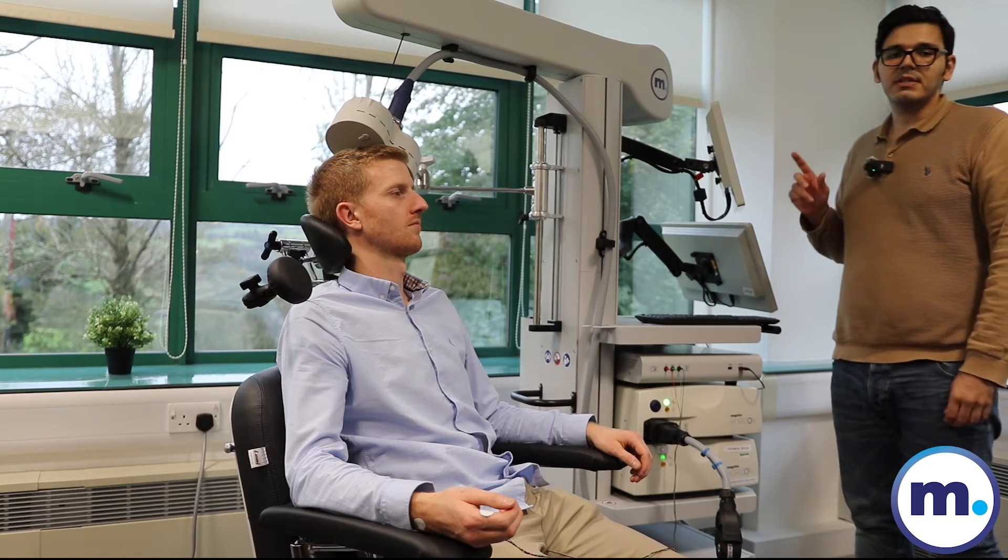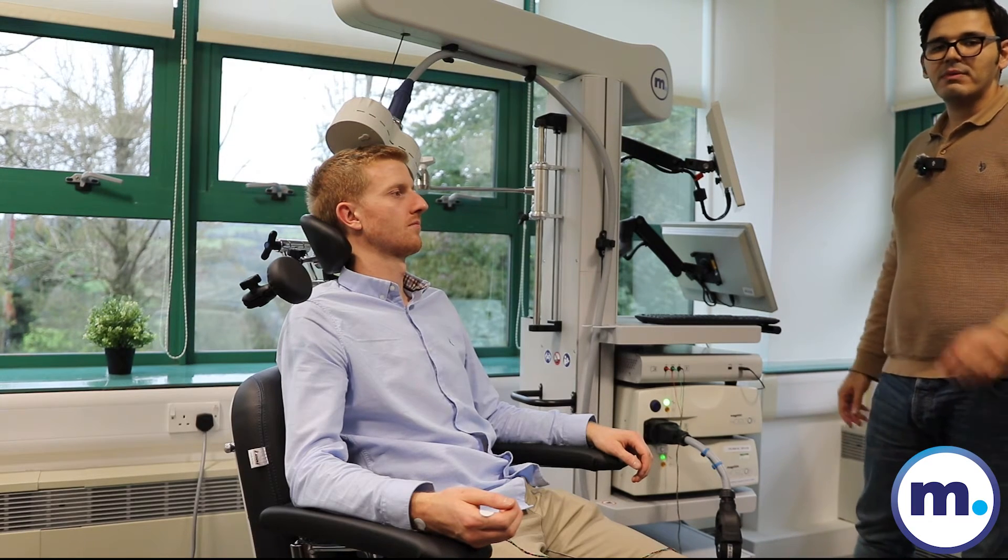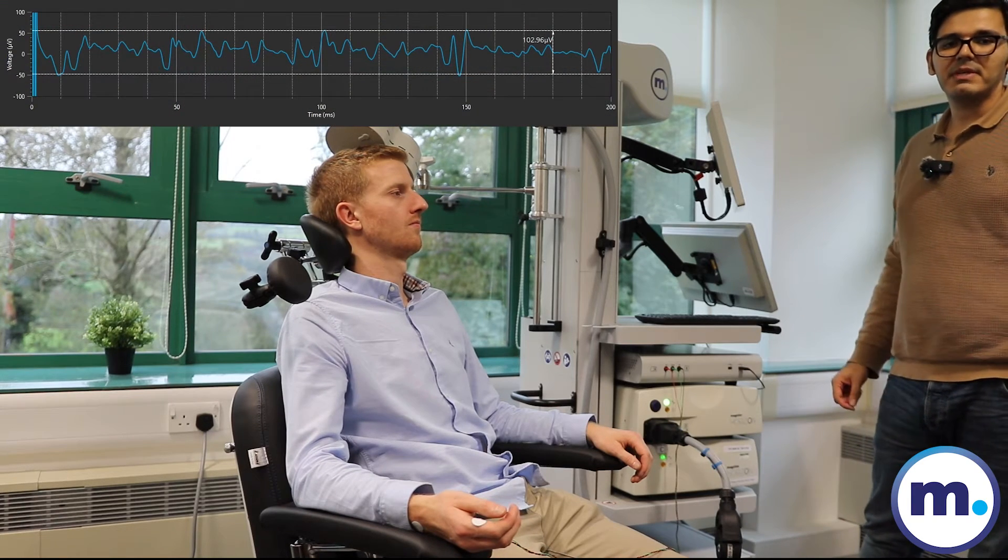The intensity is adjusted around the motor threshold, so we may see some finger twitch in some pulses and we may not. But we will also see the MEP result based on all pulses.